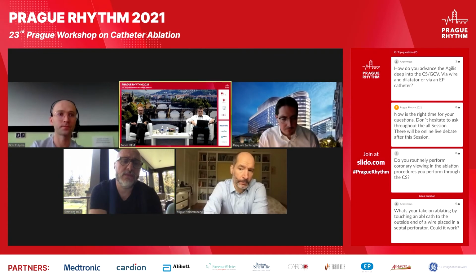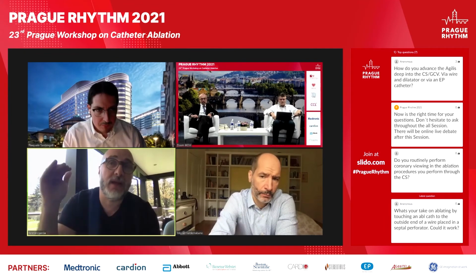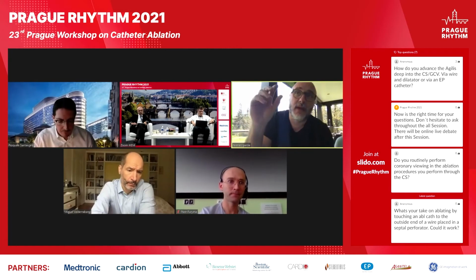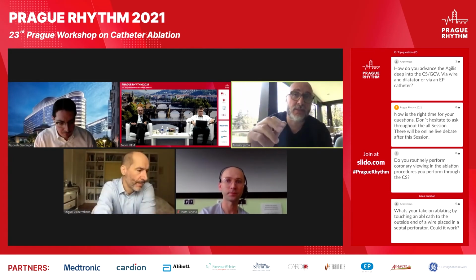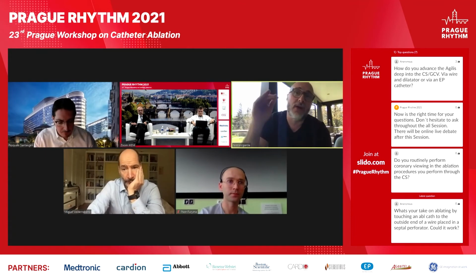And one other question that's for you, or maybe for other presenters. Do you routinely perform coronary viewing in the ablation procedures from coronary sinus? I will let the others also answer, but what I do for all the cases is what I describe in my lecture. I think the practical approach is to start always the same, and then obtain the information, analyze if it's early in the endo, if it's early in the epi, or if it's early intramural, and then design your ablation strategy. I do exactly the same thing for every patient.